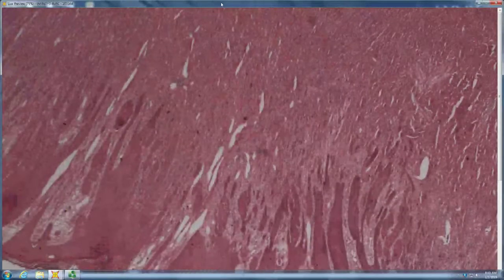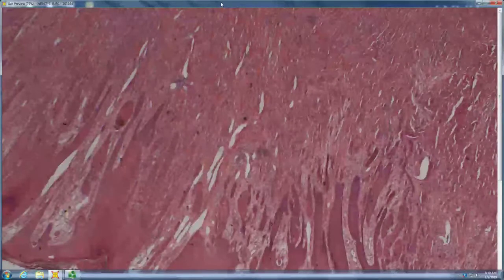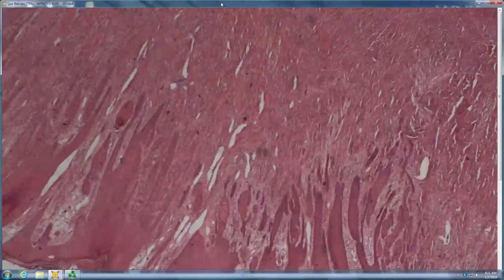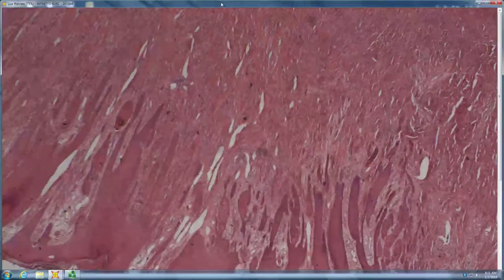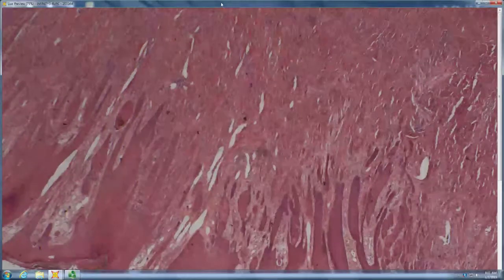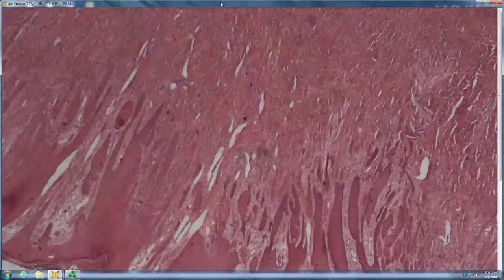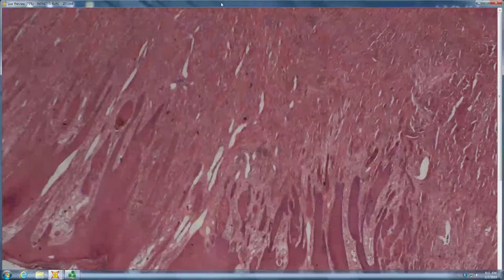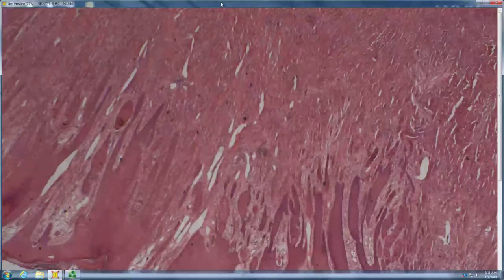That and necrotizing sialometaplasia are the two big mimics in oral mucosa, and warty dyskeratoma. I guess those are the three big mimics. Warty Ds are crateriform tumors on the usually alveolar ridge that you've got to recognize the acantholytic dyskeratosis and the fact that it's not a squamous cell carcinoma. Don't cut the jaw out. Granular cell tumor, massive PEH, necrotizing sialometaplasia.